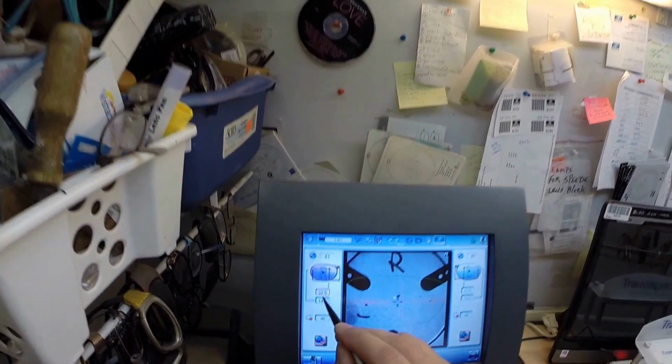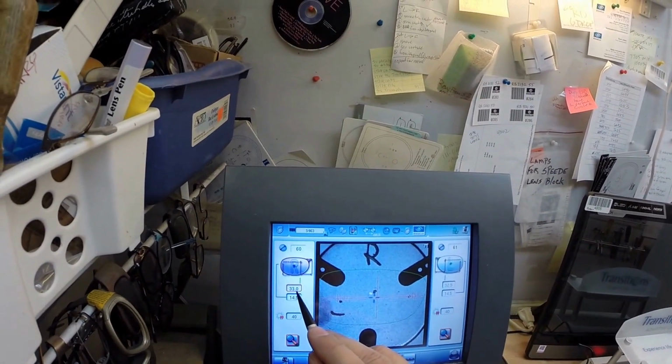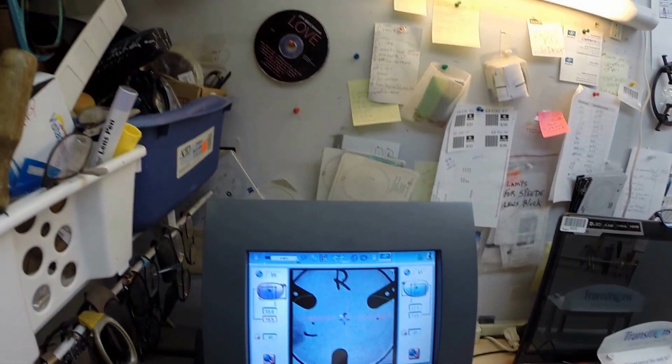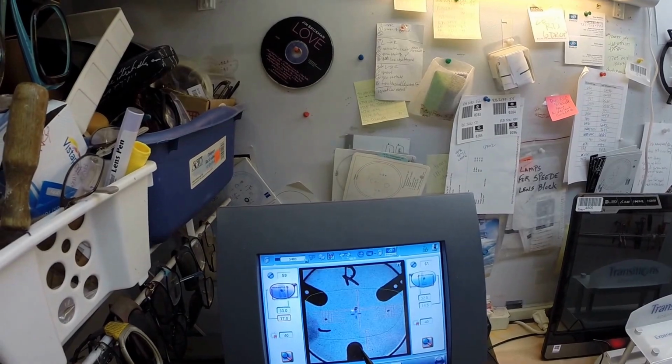Now, the pupillary distance for your right eye is 33. It starts at 32.5, so I'm going to hit this plus button one time until it magnifies to the correct size. I do want to do an optical center height of 17, and we're going to bring that up there and change the layout, and there we go.